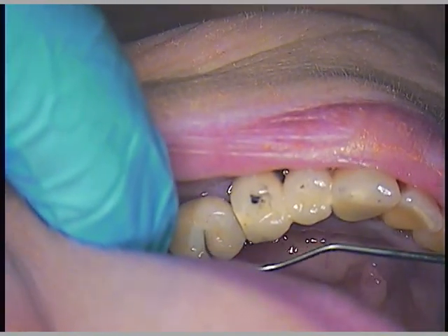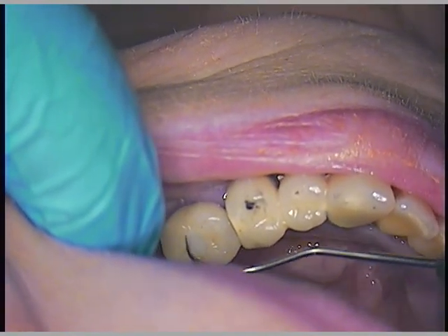We use Teflon tape to cover every screw, so even if it did come loose again, you don't have a big issue getting back to the screw head.